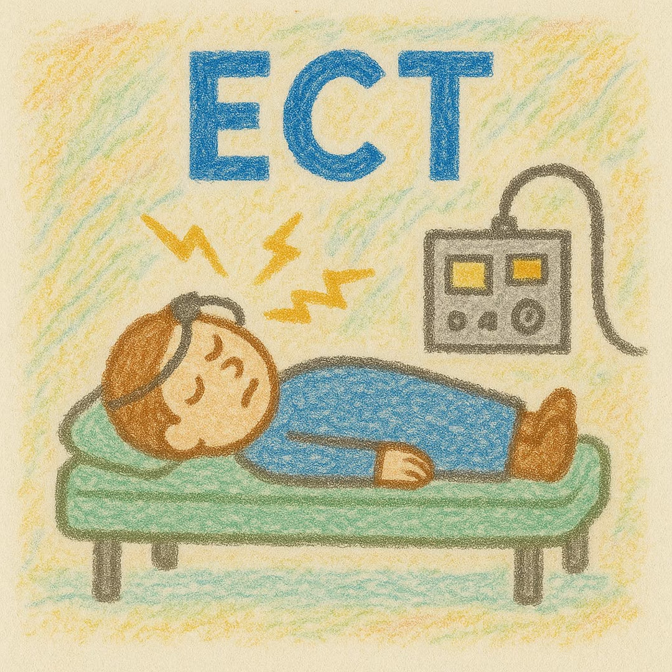So basically, just to review, we're looking for an adequately long seizure, at least 15 to 20 seconds by motor, by convulsions. And we're looking at the amplitude of the seizure on the EEG. We're looking at post-ictal suppression and just how rhythmic and coherent the two hemispheres are together. And if all those things are looking good, then we're going to keep the same dose that we've got. Over time, however, the seizure threshold tends to increase.